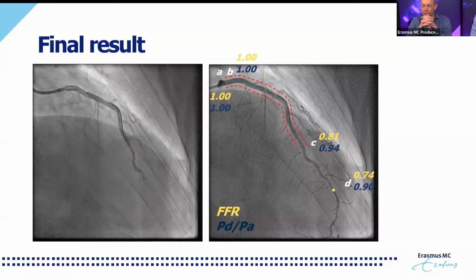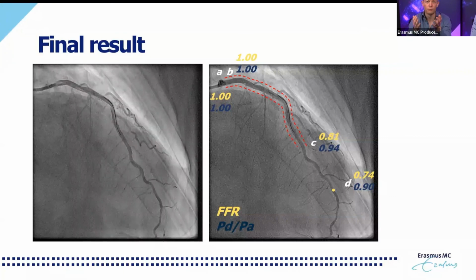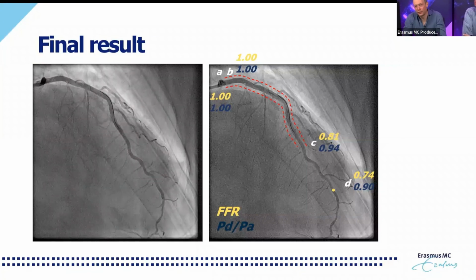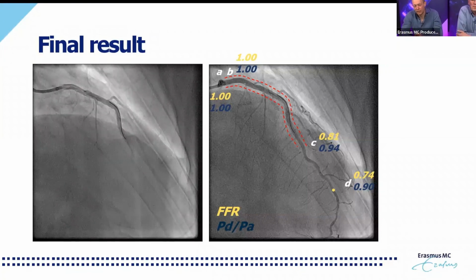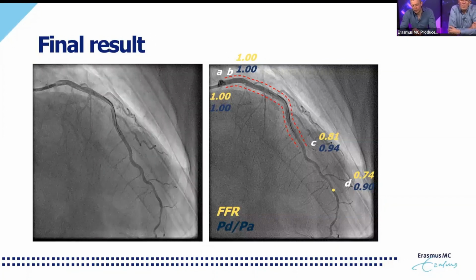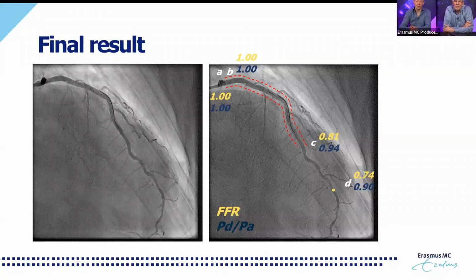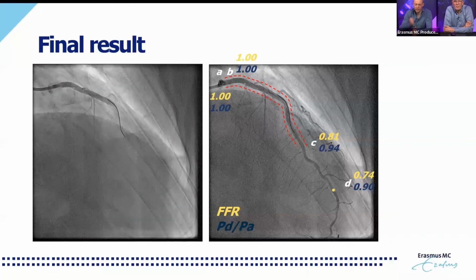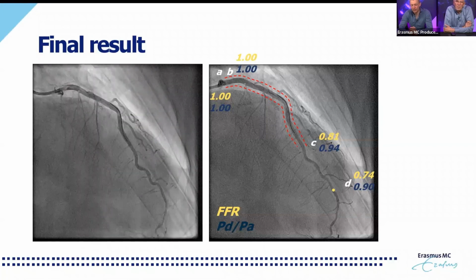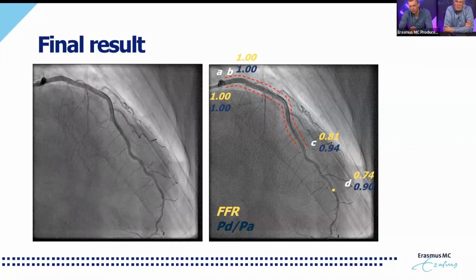Conversely, the question here relates to what kind of threshold you would use based on FFR alone in order to put in more stents. Now, that is, of course, the million-dollar question that is currently being addressed also in the DEFINE GPS trial, which is an event-driven trial. I think that will enroll up to 4,000 patients, randomized to either angio-guided PCI or iFR-guided PCI using the pullback algorithm, in which you need approximately a gradient of, let's say, 5 points in order to put in more metal.